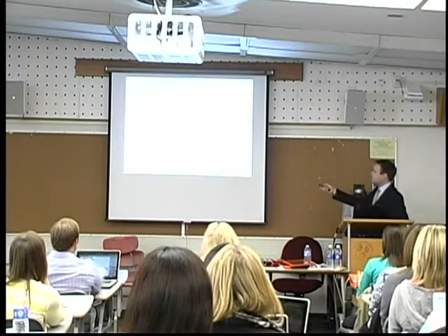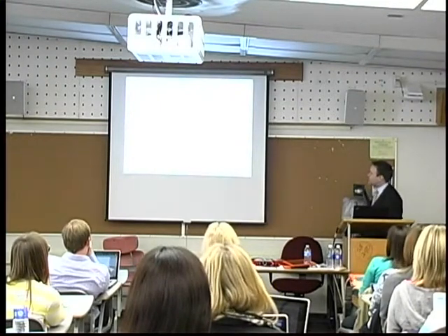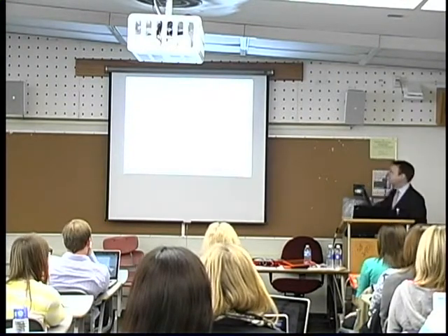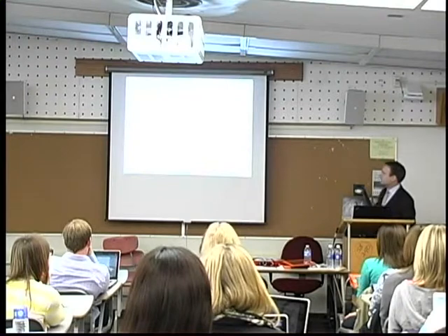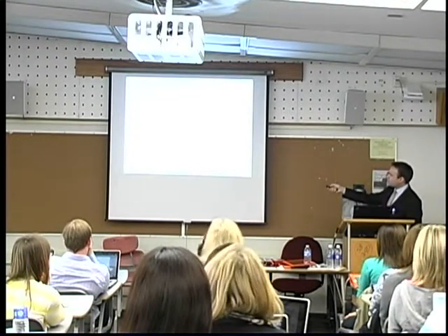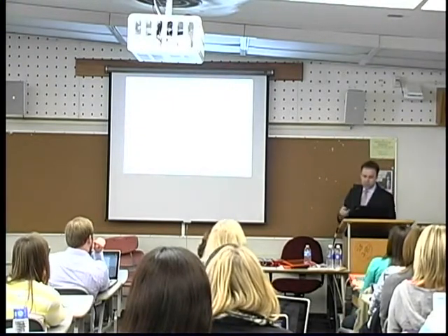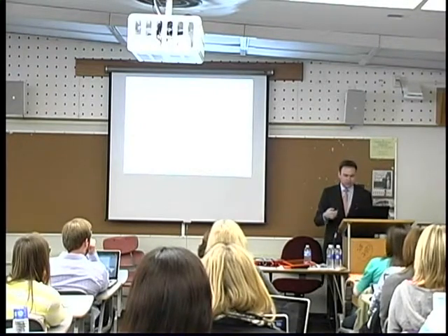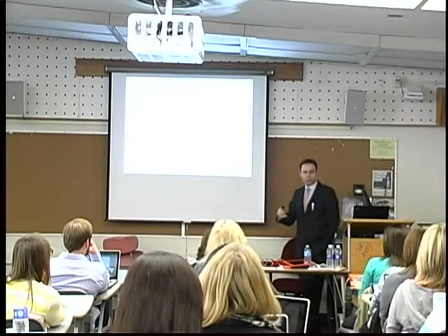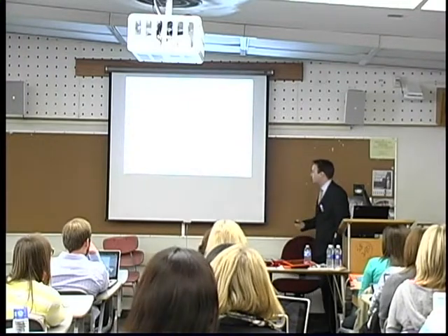In 2009, Ralf Schlosser from Northeastern University said SGDs represent a viable and effective AAC option for individuals with ASD. He had also reviewed the research base and is one of the lead investigators in this arena. These days, we tend to think that the empirical evidence speaks a clear message and that the effectiveness of SGDs should no longer be questioned. And this is an important point to keep in mind because you will often run into issues with insurance companies and service providers when trying to get funding for a speech-generating device.